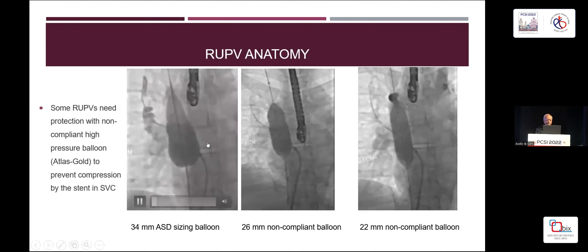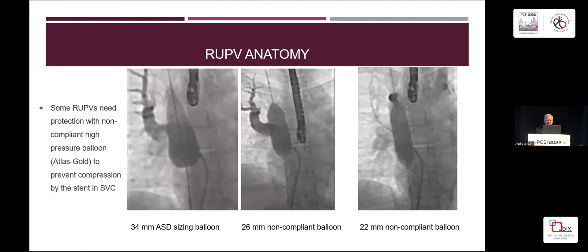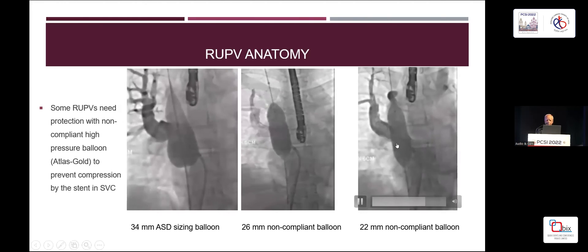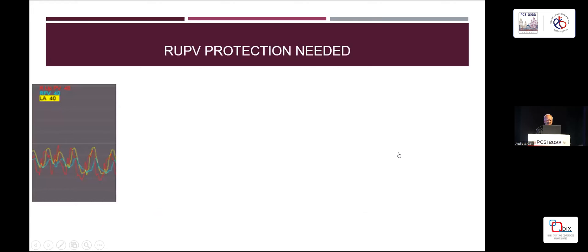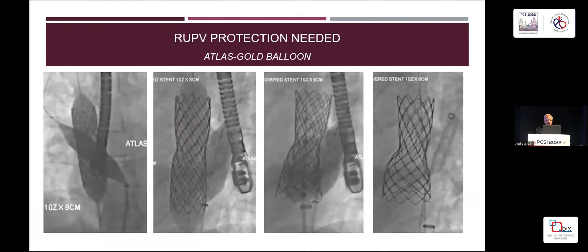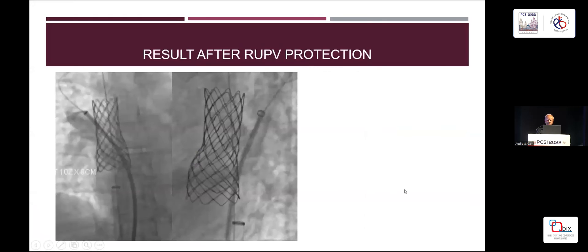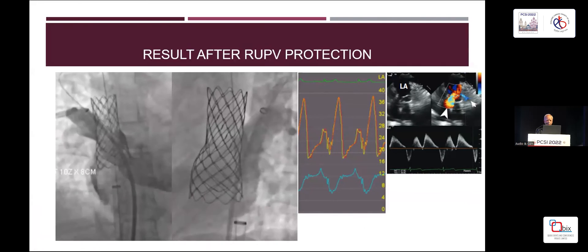Here's one with balloon interrogation showing holdup of contrast with the sizing balloon. We then tried a non-compliant balloon, and that still showed some holdup at 26 millimetres. With a 22 millimetre non-compliant balloon there is no holdup of contrast, but there's residual shunting. If you oversize the stent, there will be a gradient. So you have to decide on protecting that right upper pulmonary vein. Here we've got an atlas balloon in the right upper pulmonary vein on the lateral projection, and inflating the covered CP stent produces an indentation — that allows the pulmonary vein to be protected. There's a tiny residual shunt on the angiogram afterwards, which can be resolved by flaring a little more.